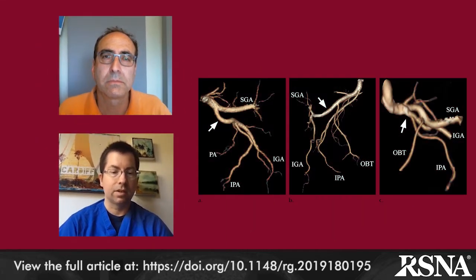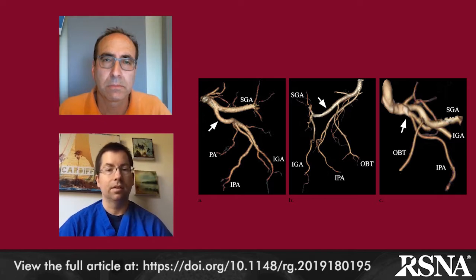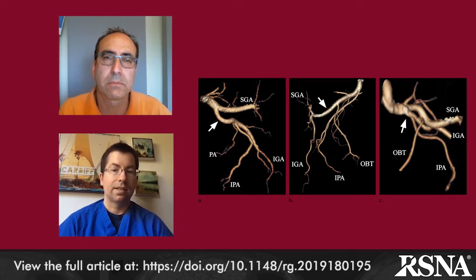A detailed understanding of the pelvic arterial anatomy is needed to safely and effectively perform prostatic embolization. The internal iliac artery branching pattern is highly variable. There are several different classification schemes. The Yamaki classification provides a simple to understand scheme based on the 3 major branch vessels. The most common variation is shown in figure 1A. In this configuration, the internal iliac artery divides into the superior gluteal artery and a gluteal-pudendal trunk. These are the anterior and posterior divisions. The gluteal-pudendal trunk then divides into the internal pudendal artery and the inferior gluteal artery.